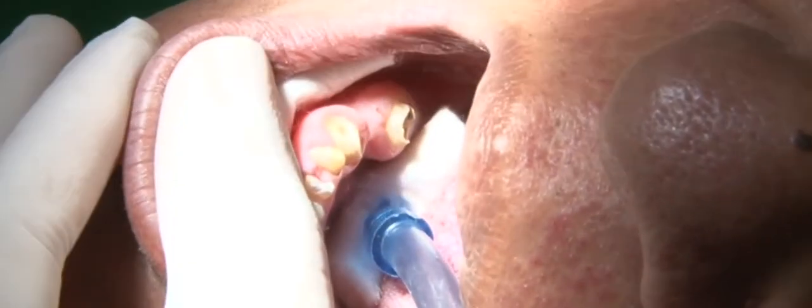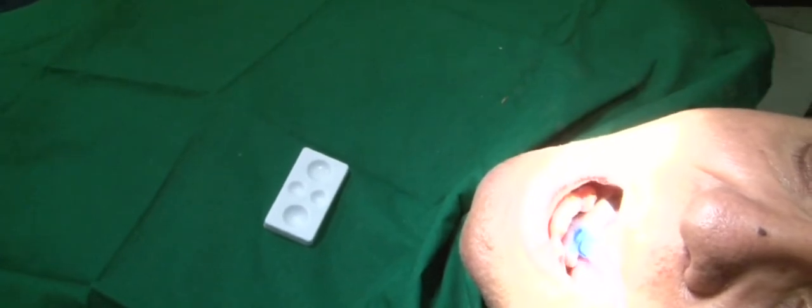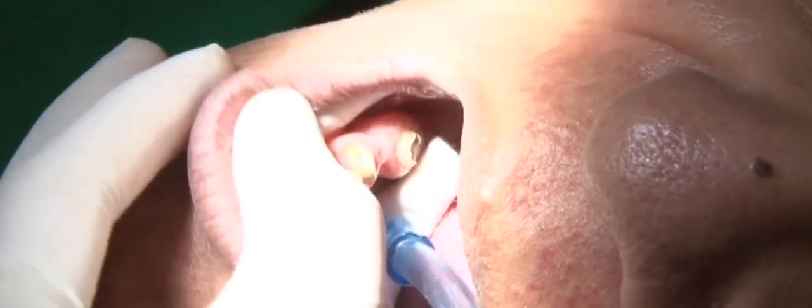As soon as the tooth is primed, my assistant simply hands me the Smart Mix syringe and I inject it into the tooth. I do not have to wait for her to mix anything or load it. Luxa Core Dual is not very viscous and flows very easily into the prep, ensuring complete adaptation to the preparation walls.